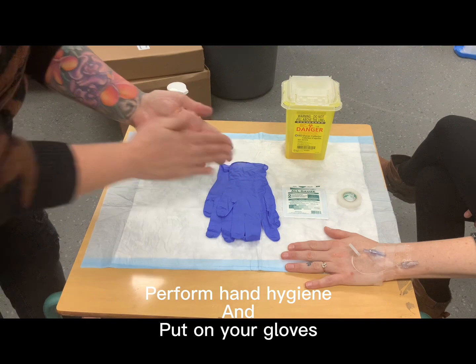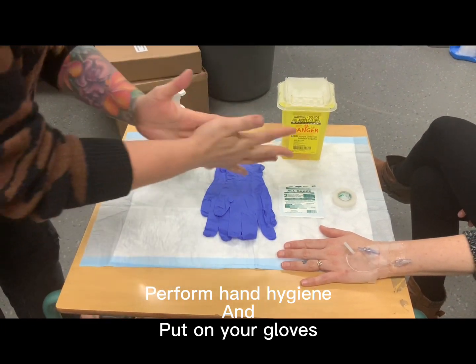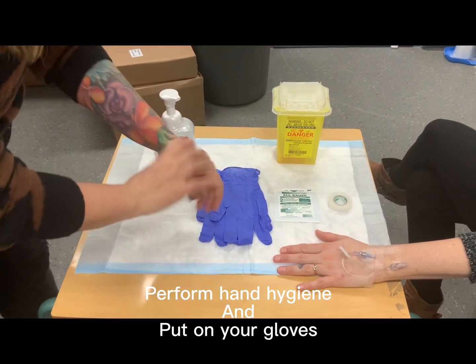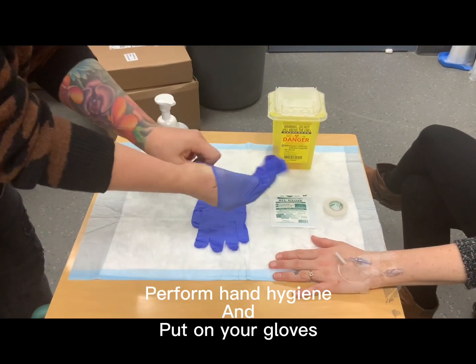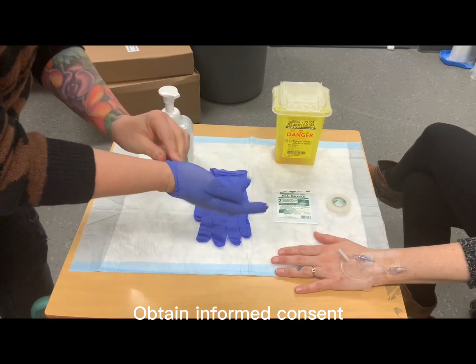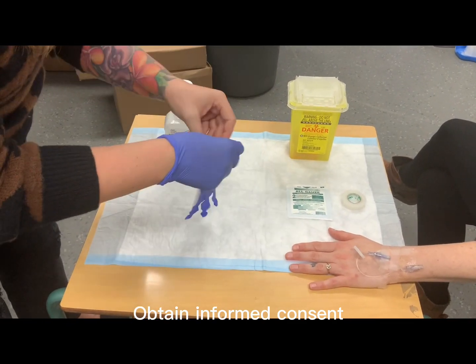Perform hand hygiene and put on your gloves in front of the patient. Explain the procedure to your patient and the need to discontinue the IV. Explain what's involved in discontinuing the IV before you start.